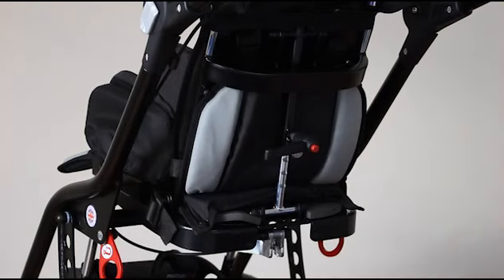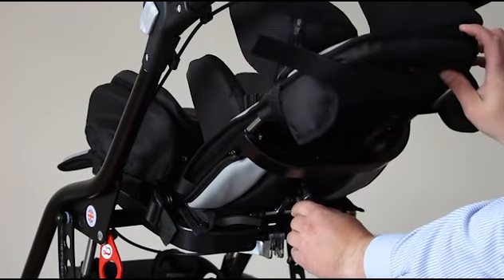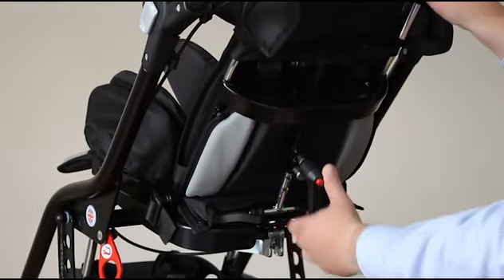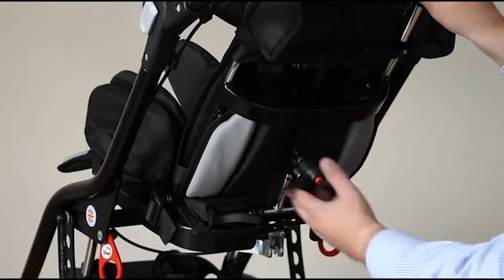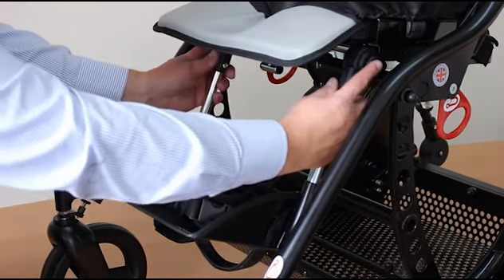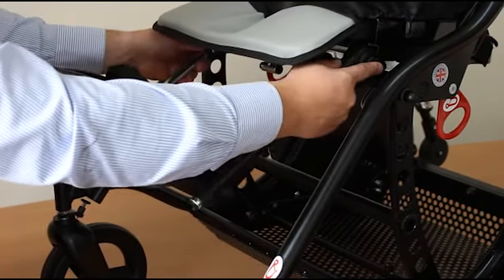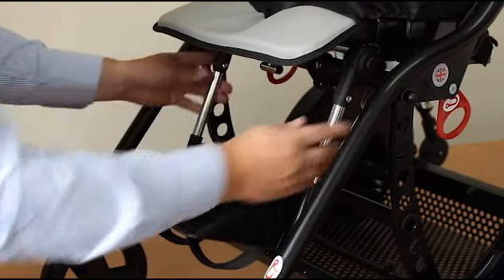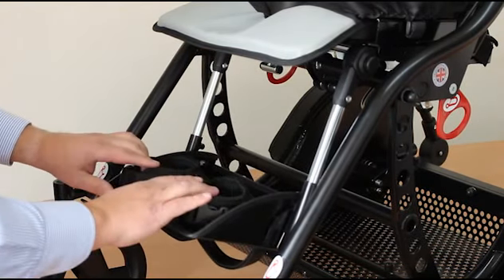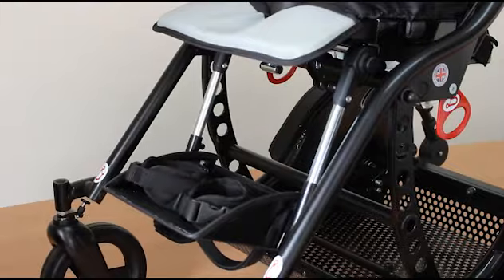The backrest on the seat unit also reclines — undo this handle, release the pin, select one of the pre-set positions in the backrest recline, and once you've set the correct position, wind this in to secure the backrest properly. The footrest on the tandem buggy is adjustable — press these buttons in to release it into the desired position. The footrest itself folds up for loading and unloading, and we can fit a variety of angle huggers and foot straps on the footboard to secure the feet.